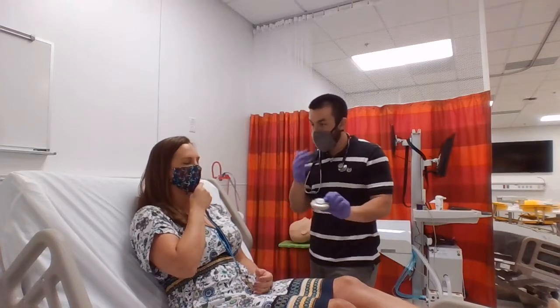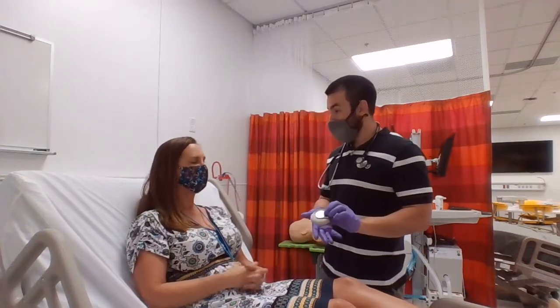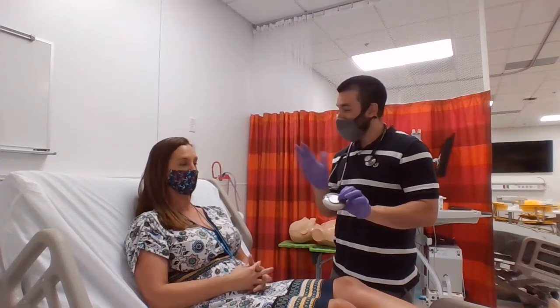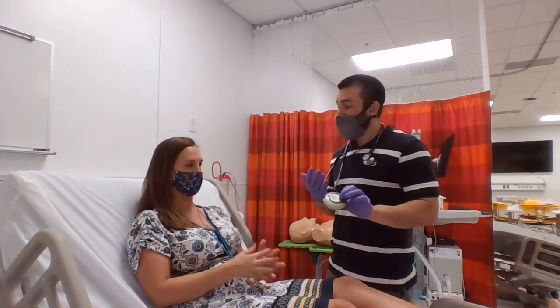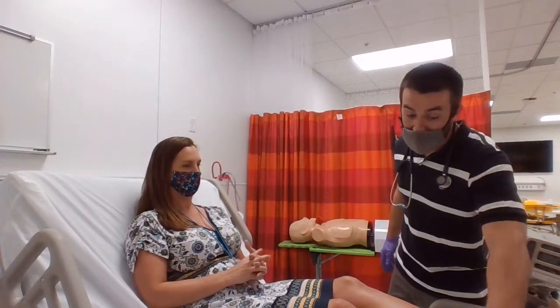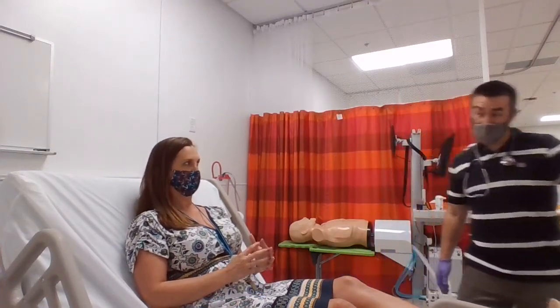So once again, remember, fast deep breath with this one because you got to pull it out. Check and make sure that powder is not around that mouthpiece. If you accidentally blow into it and it sprays, that's why it tasted off that time. It's not supposed to taste good, and a lot of this does deposit in your mouth.